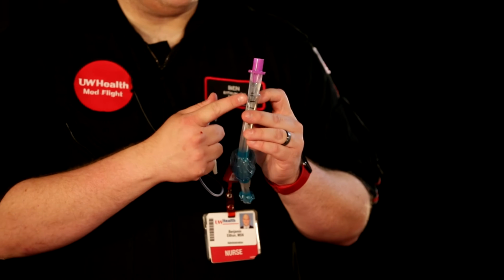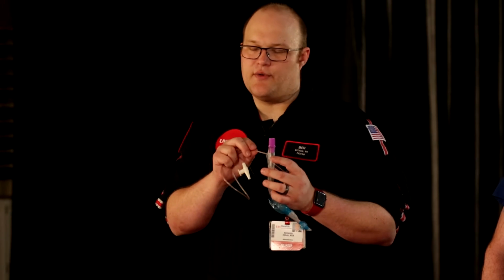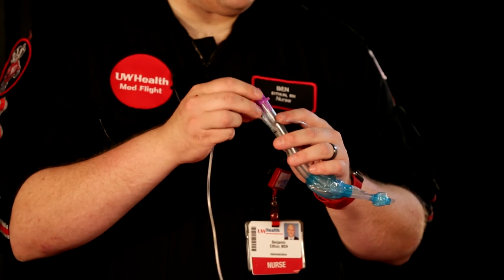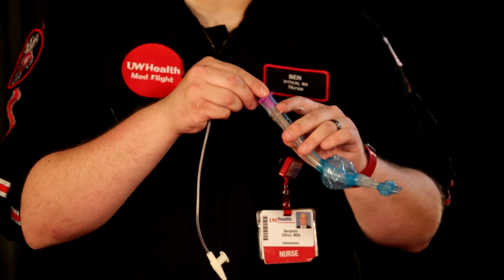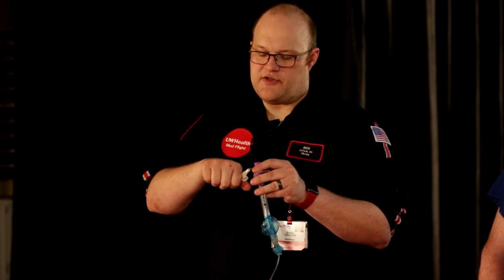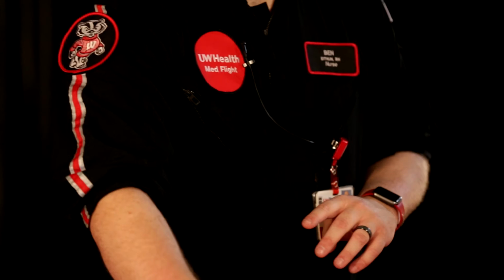Absolutely. So the King tubes come in different varieties, so you want to make sure you know what you have in your facility. Some of them have this port that says OG and it has a catheter size. That can be helpful for two reasons. One, it's going to be a passive valve, so that once you place it and start bag ventilation, it's going to allow air to escape. But you can also send either an OG or a suction catheter down. You want to make sure it comes out the tip and then pull it back so that when you place it, it's in the right spot. Once it's seated, you can drive that down into the esophagus, into the stomach, hook it up to suction, and then you can decompress the stomach after you do insertion.